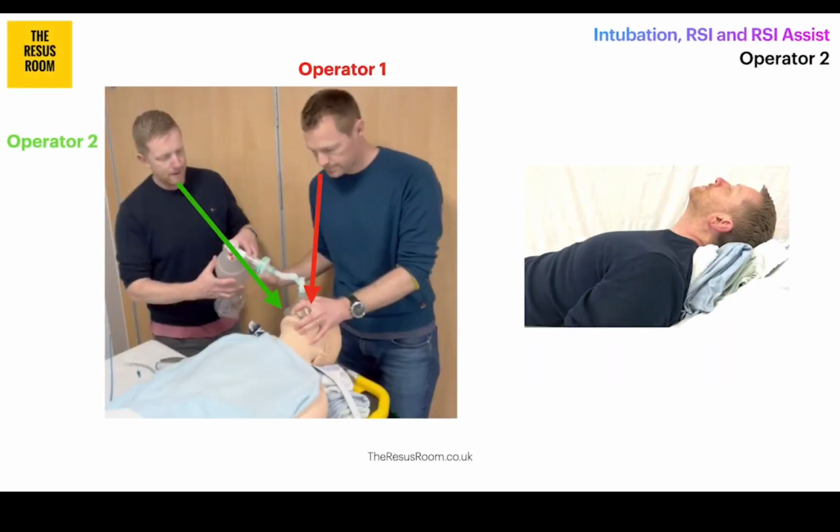Okay, so now we're on to preparation of the patient, and in particular I think positioning is worth looking at, because while Operator 1 should definitely determine the height of the stretcher for intubation, from their position above the patient it is really difficult to determine whether the ear canal is level with the sternal notch. However, Operator 2, who's standing on the side of the patient, is perfectly placed to assess the efficacy of any ramping or head positioning. There is a reason that we took these pictures from the side. So Operator 2 should absolutely lead on that aspect of patient preparation.